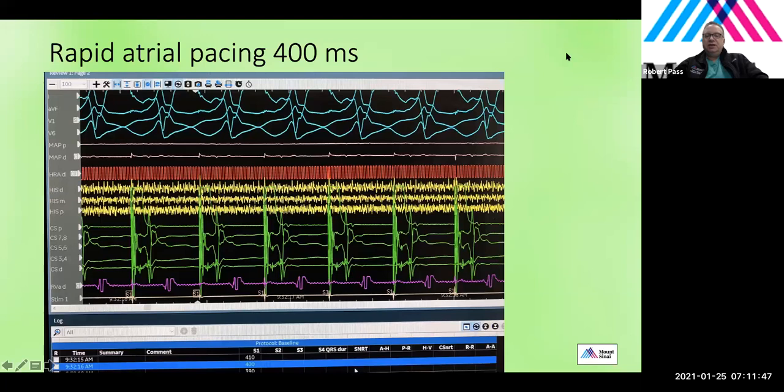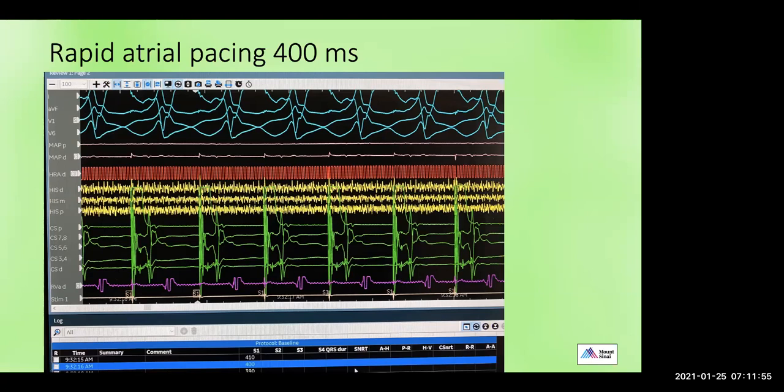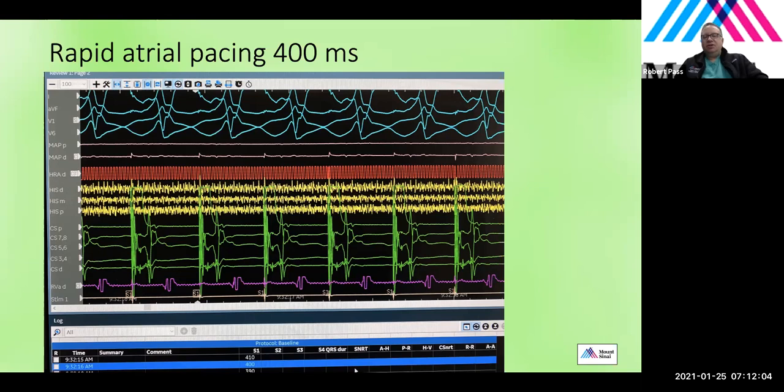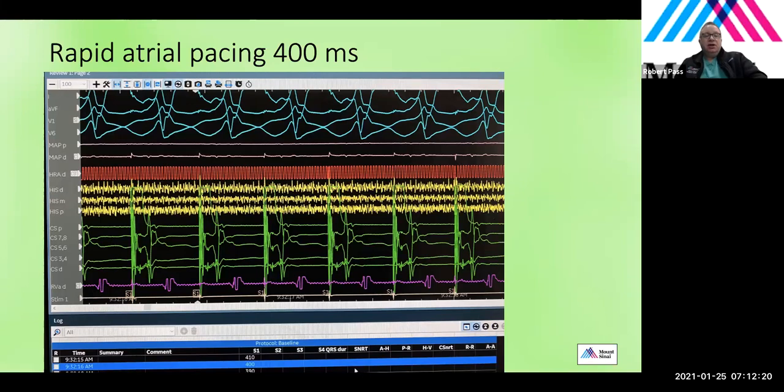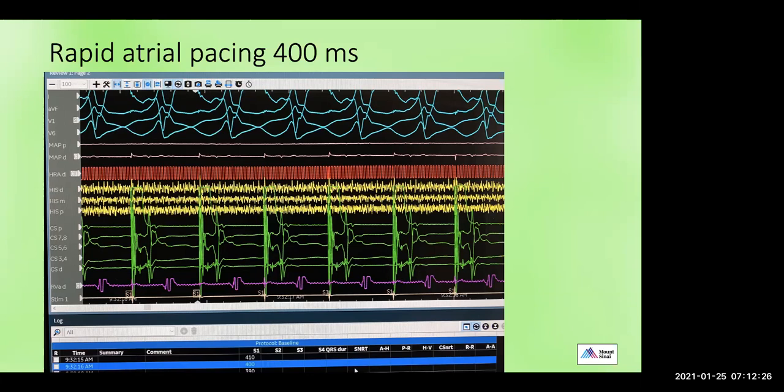Why are we rapid atrial pacing, Grace? Why do we rapid atrial pace during a WPW case? You want to determine the refractory periods. Well, why don't we get more basic? What am I trying to figure out about the pathway? Maybe you can figure out if there is a decremental characteristic to the AV node. No, what we're trying to do is figure out whether the patient is at risk for sudden cardiac death, right? Oh, yes.